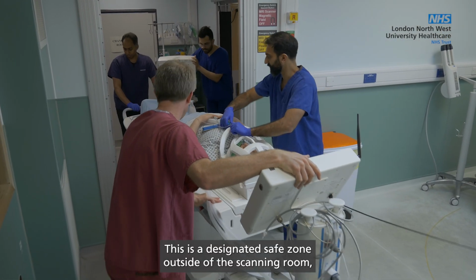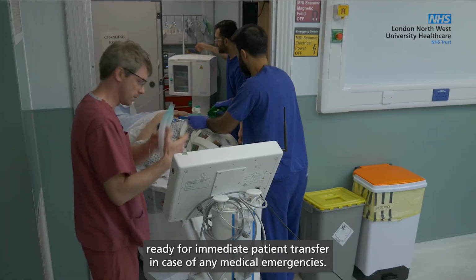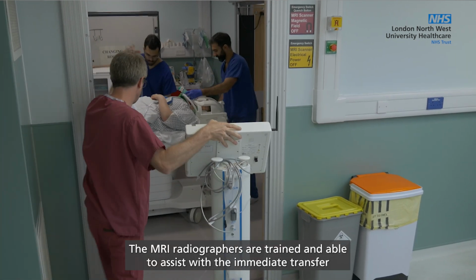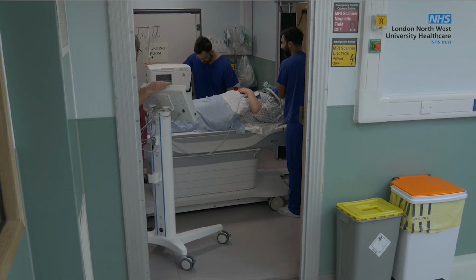This is a designated safe zone outside of the scanning room, ready for immediate patient transfer in case of any medical emergencies. The MRI radiographers are trained and able to assist with the immediate transfer of patients outside of the scanning room in case of an emergency.